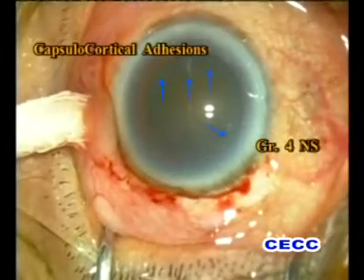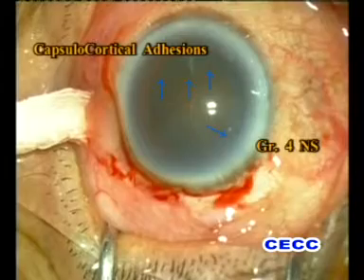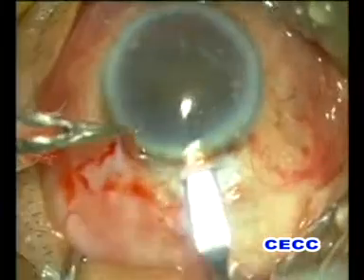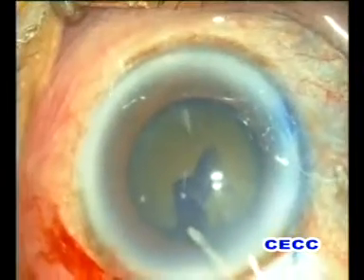This is a 75-year-old restless elderly lady with plenty of systemic illnesses and a grade four nuclear cataract with dense capsulocortical adhesions. Cataract surgery was planned through a superior scleral tunnel. A moderately large rhexis was made.